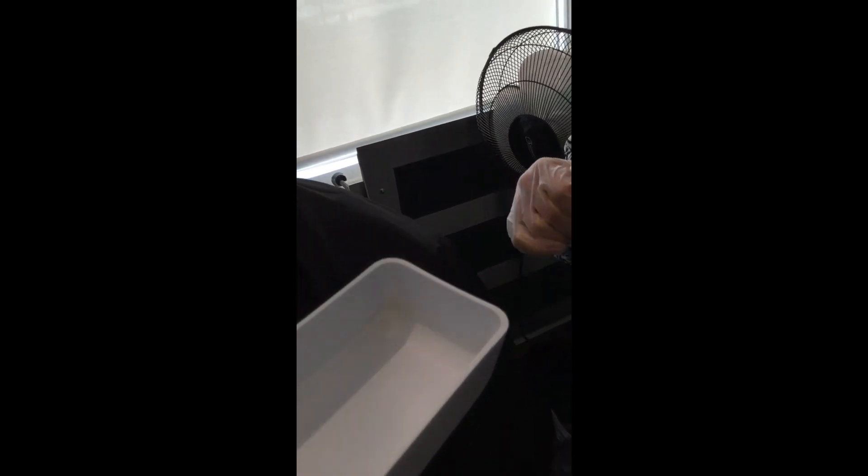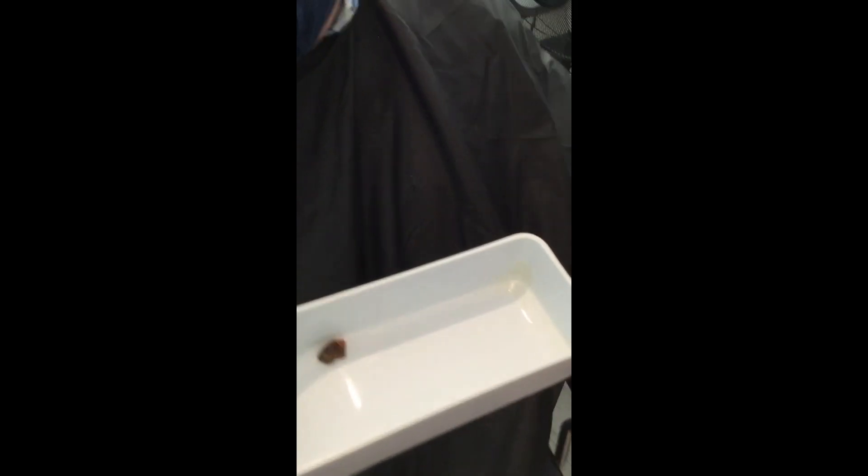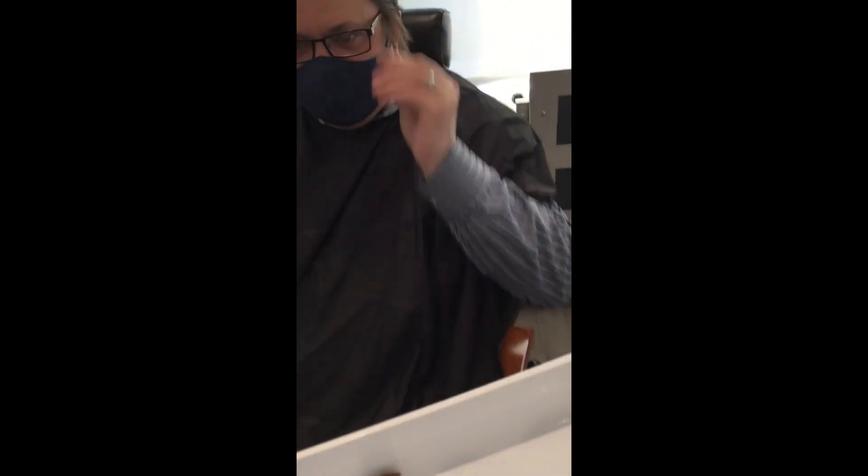Do you want to see what came out? Yeah. Oh my, I need to put some glasses on. Did you get a good look at it? It was actually a bigger chunk than we thought it was. I'm just going to keep looking. So there's that, and then in there there's a tiny bit of dissolved stuff.